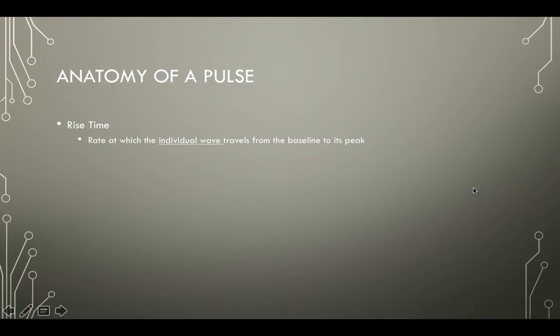Okay, so what else can we affect in the waveform? So we have the rise time. This is the rate at which an individual wave travels from its baseline to its peak. Rise time comes into play when we start talking about accommodation.